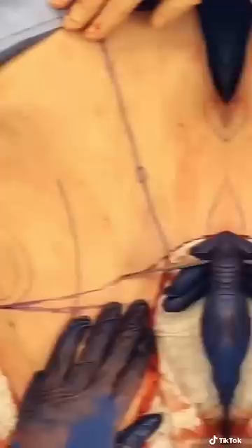Next I remove the excess skin and fat from each side. I typically remove a symmetrical amount off each side, which weighs a couple of pounds. And you can see one side of the excess skin that I've removed.